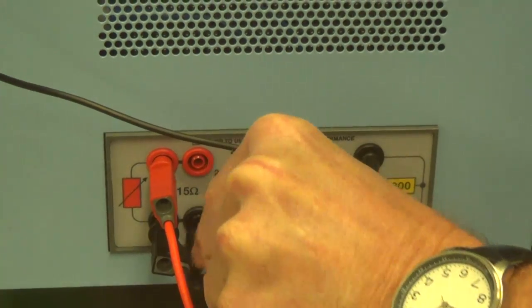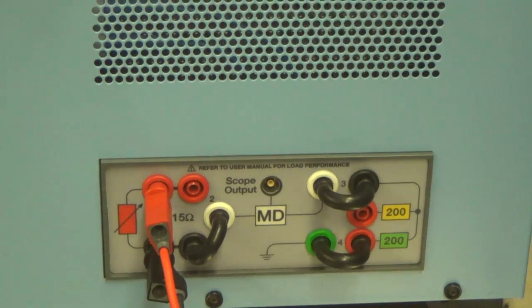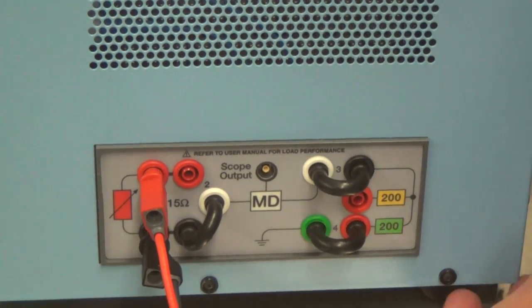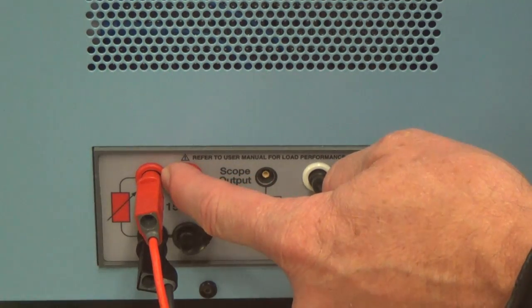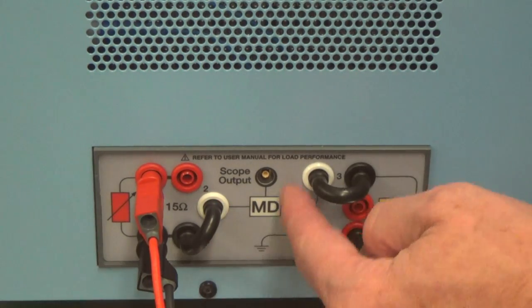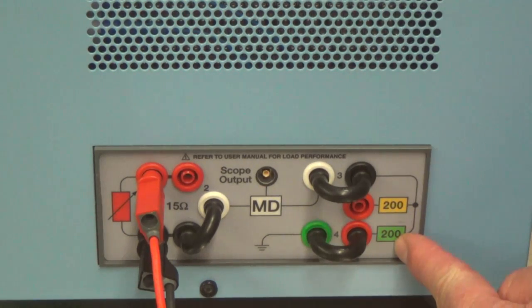So what are we doing right here? We're building a circuit. What kind of circuit are we building? We're building a circuit that has that 200 ohm resistor that the IEC 60601-2-2 wants us to have. So the bipolar energy comes in there, goes across here, and then this jumper feeds it to here, and then down here we put the 200 ohm resistor in line.